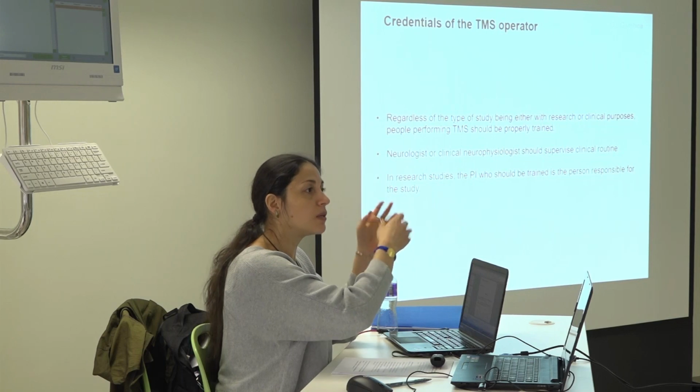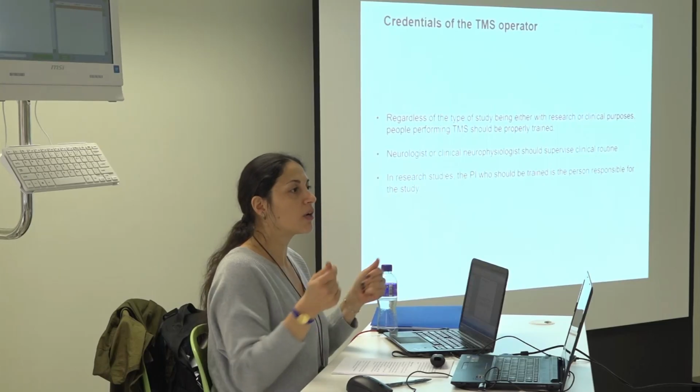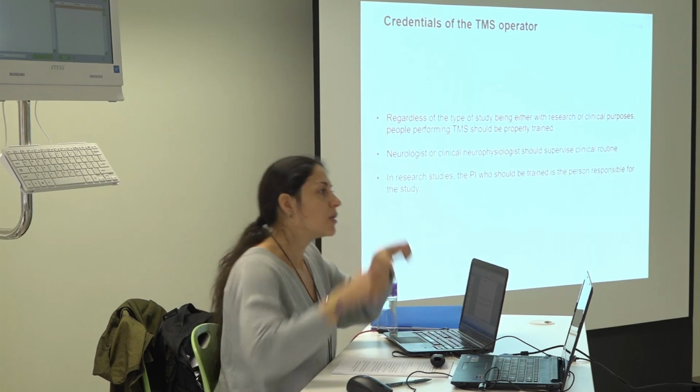And so you should have some training, kind of the training we are having now. So now you have some knowledge, so there are some safety guidelines you need to follow. We can do some TMS now to see how you do this, but you need to know this. It's not okay to say TMS is easy, put the coil, and that's it. Not only that, it's irresponsible.